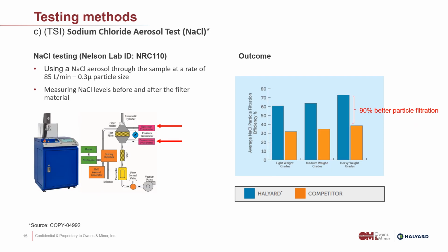And now we're going to come to the last test, and that is a salt test. This is not what we call a normalized test. There's no standard that describes this, but it is a generally accepted test for filtration. You can look this up on the internet and look for TSI sodium chloride aerosol, and you will find different little videos about how it works.